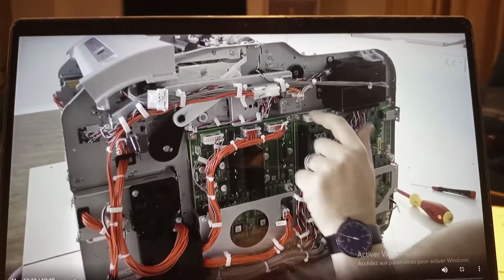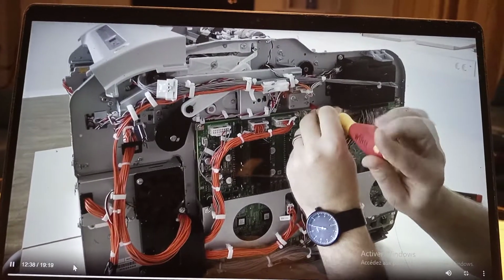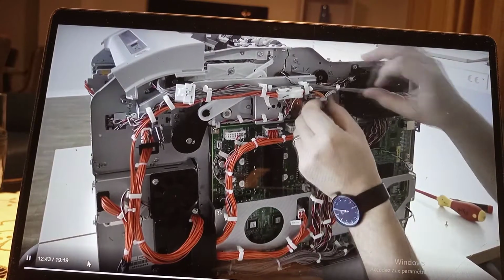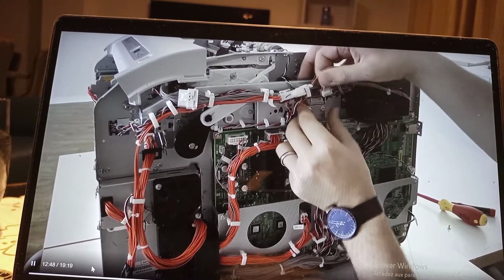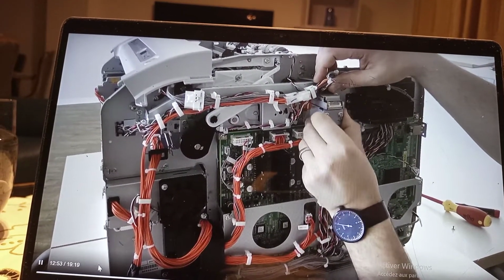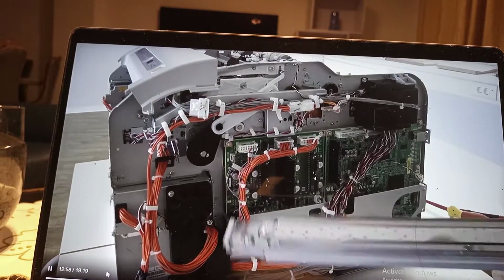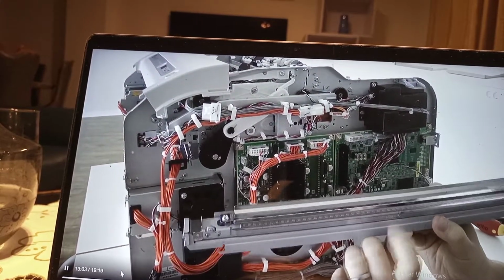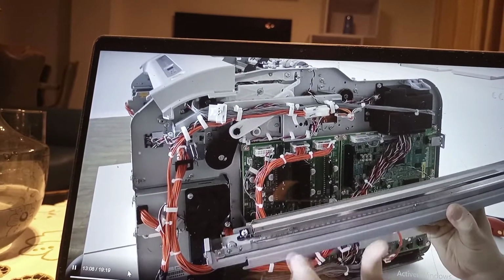You just need to unscrew one screw on the right side, unplug the plug for the lamp, and gently pull out the erasure lamp like this. So that's the lamp. Here in between the image plate will be passed by. Just be careful not to bend this top device because it also works like a mirror.